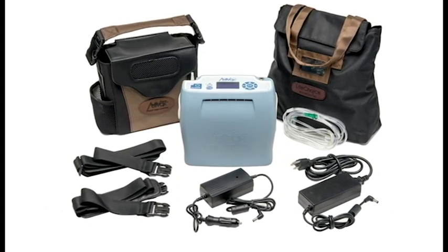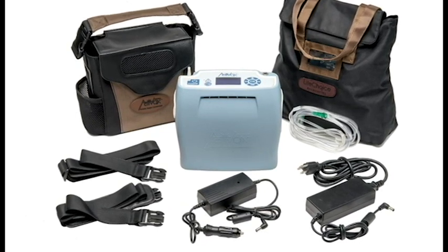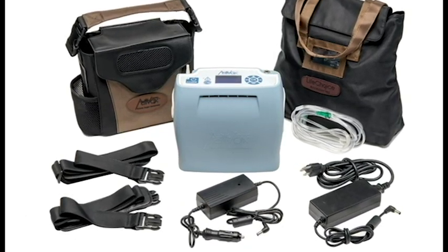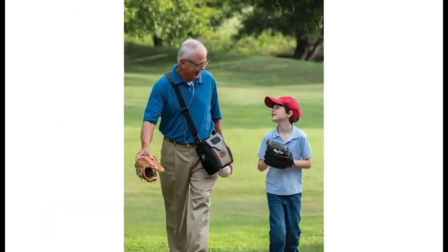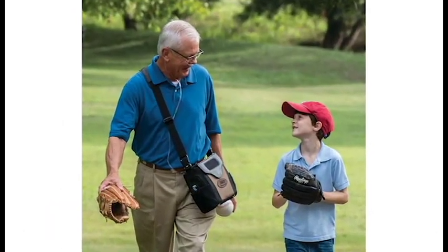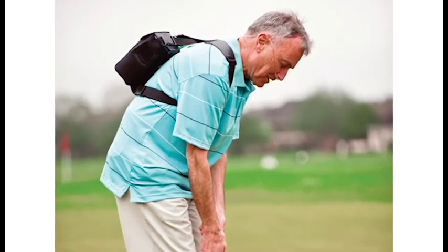You've got your accessory bag for your external batteries, your AC and DC power supplies, tubing, anything you may be traveling with. You've got your carry case that can be carried with the short handle, the shoulder strap, or of course those shoulder straps that can be used as a backpack so you can wear it around your back — just very easy to travel with.